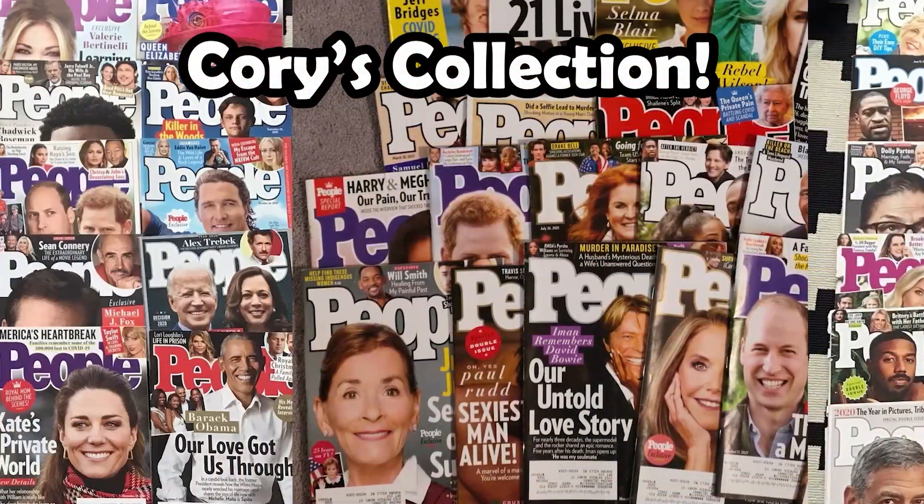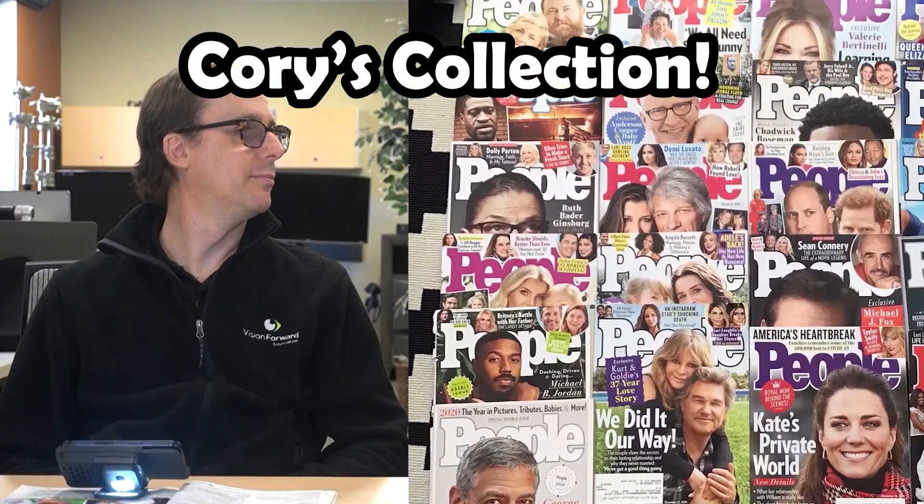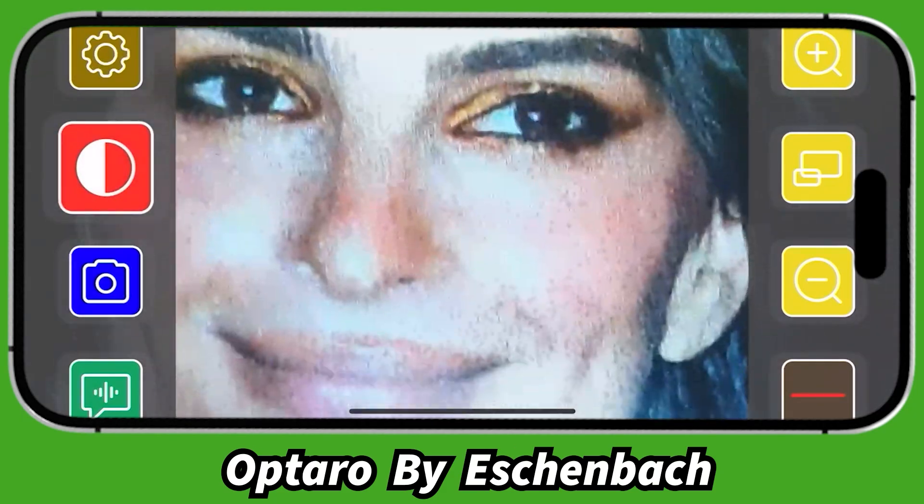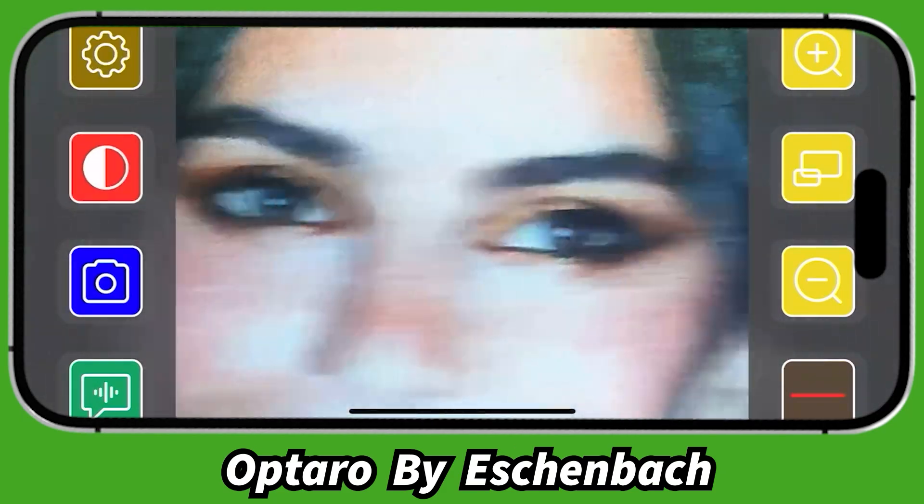Now that we have the Optaro together, it's time to put it through its paces using a special magazine from Corey's collection — a People magazine from the October 17th, 2022 issue, which ranks number six of his favorites. It highlights the relationship between Brad Pitt and Emily Radoslowski. Here's Emily in black and white — let's go ahead and hit the color mode button a few times. And now here she is in regular color. We'll look at Brad as well.